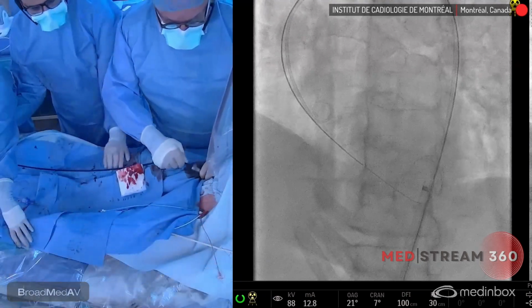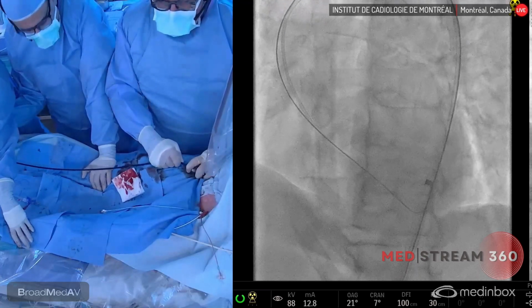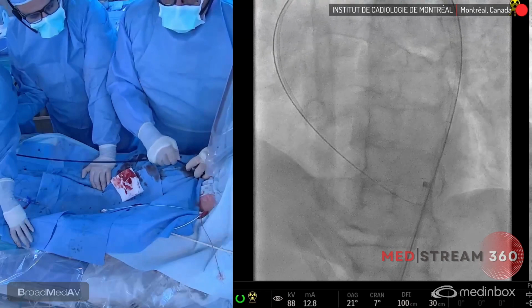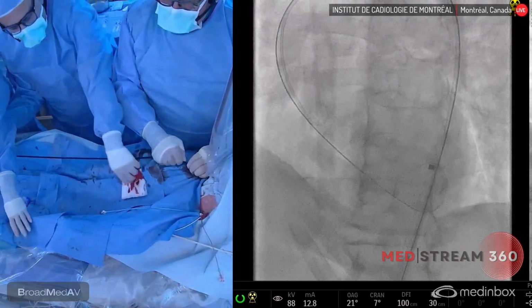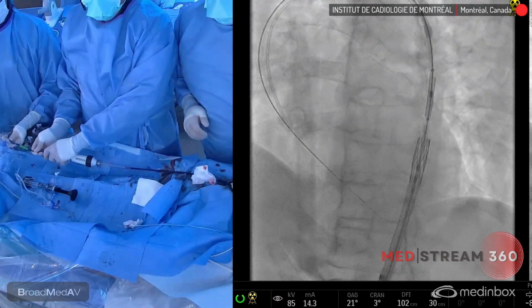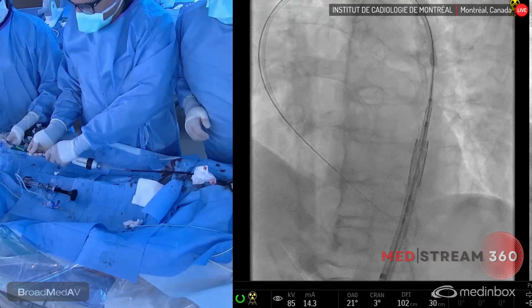So we're just talking about what's the best deployment, and to the point that the coronary is a little bit low, as opposed to maybe a really high deployment, sort of 80-20 or 90-10, probably going to err a little bit more on a lower deployment, maybe more 50-50. Just trying to find the right angulation to be able to load the valve onto the balloon. Often it's more cranial, not in this case.